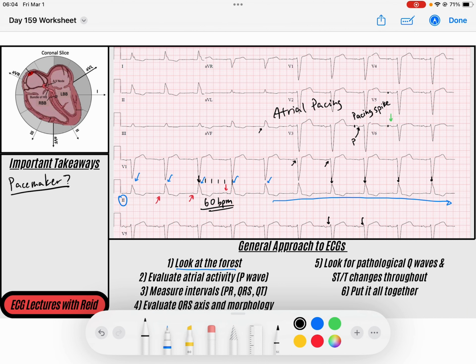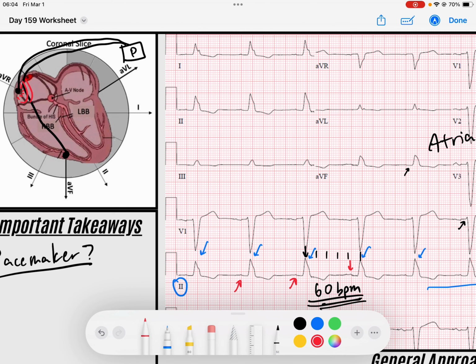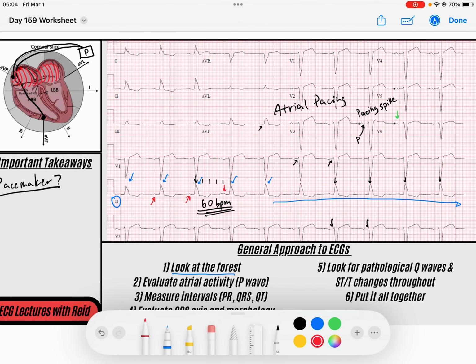Okay. So let's try to figure out, first of all, that would explain why my rhythm is so fixed at 60 beats per minute, because the pacemaker is just ticking away, programmed at 60 beats per minute during this ECG. So that makes sense. We said that this is atrial pacing, right? So we know that most pacemakers, if this is my pacemaker box that's sitting in someone's chest, have two leads, two wires that come out, one of them that goes all the way down into the ventricles, so that if we need to beat in the ventricles, we can. And the other one goes all the way to the atria, so that if we need to beat in the atria, we can. And so we know that this person is beating in that atrial lead, and it's depolarizing the atria, right? So we know that that's happening because we see pacing spikes and P waves.